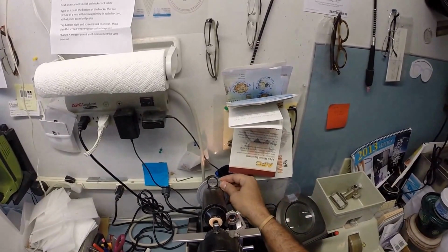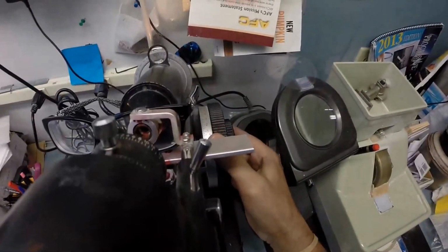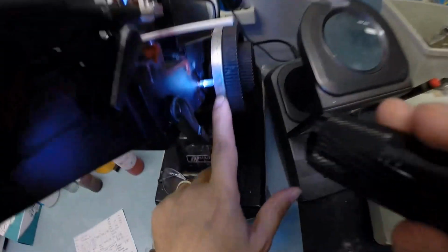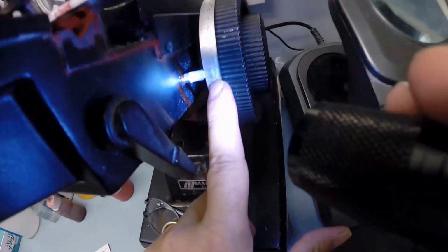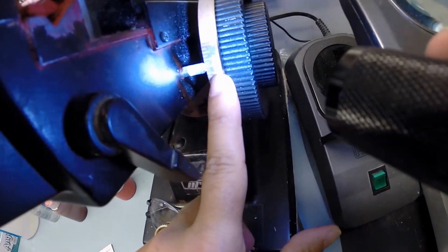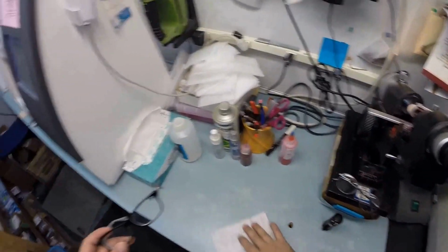We're going to spin the fine-tune knob, the axis wheel that corresponds to your astigmatism, to 106. Put the left lens in over that red dot and read the power. And I'm getting -4 1/4. Check your astigmatism correction. And we're going to end up with a total power of 5.50, exactly halfway between 5 and 6. So that is made perfectly. I couldn't make that any better if I'd done this myself. Wait, I did do this myself.